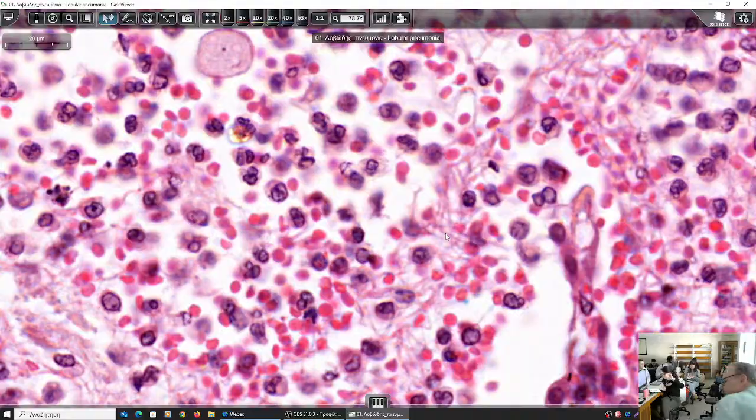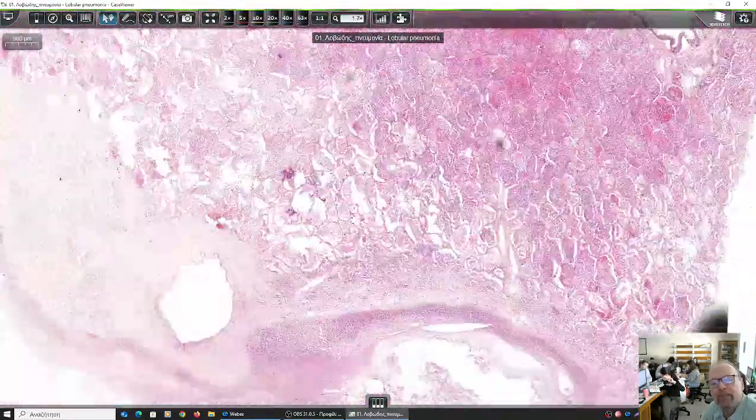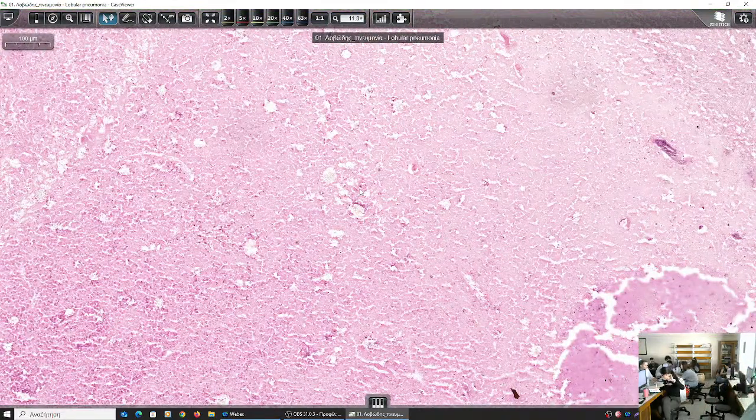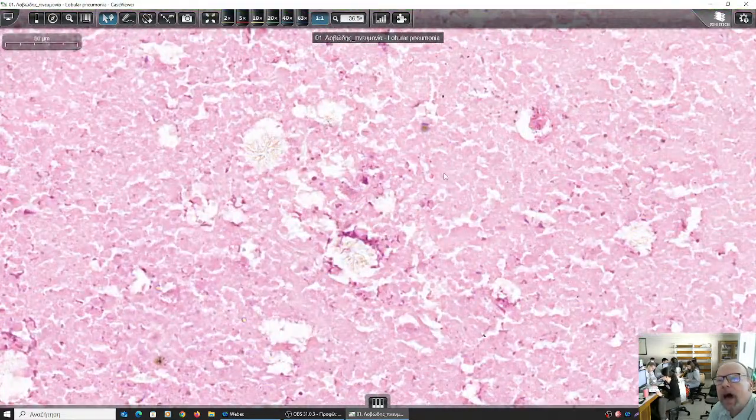And by the way, have a look here. We leave the inflamed alveoli, and we have this area. Tell me, Nico, do you identify any parts of the lung parenchyma here? Are there any septa? Are there any alveoli? Are there any viable inflammatory cells? Here, no. So what do we see here? You have a tissue that is amorphous, and it is stained. Which stain does it take, this tissue? Which stain is this?